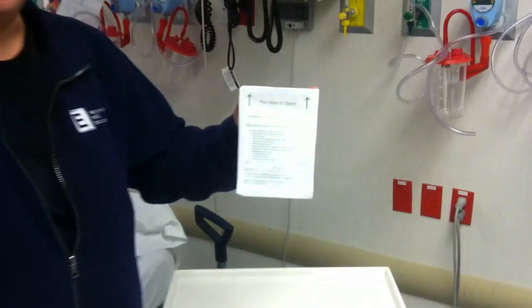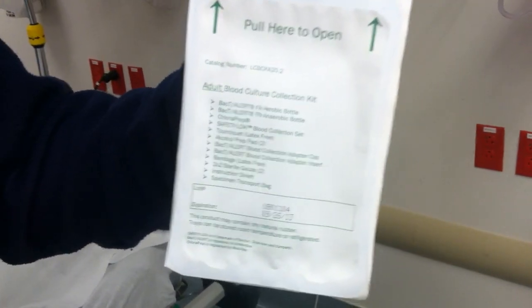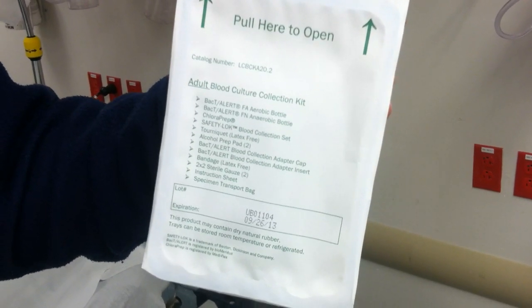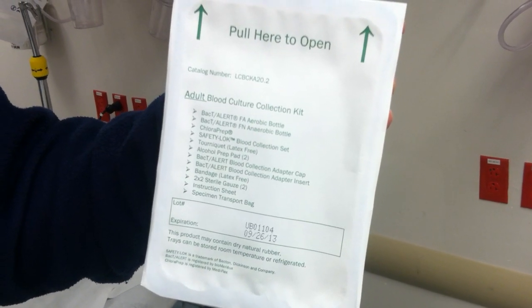This is a blood culture kit used in our facility — the adult blood collection kit. It has everything you need, including both bottles for aerobic and anaerobic bacteria, and chloroprep for prepping and cleaning the site.